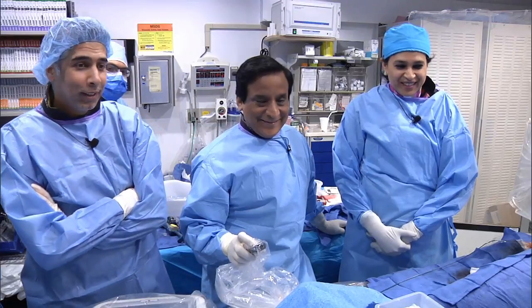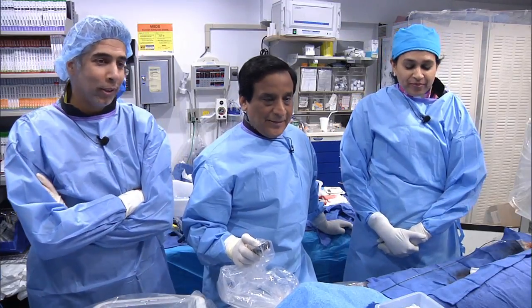Yeah. There are two quick questions I have to take. One, Dr. Syed from Oman. He's emphasizing that the fellows and all of us should be trained in both radial and femoral, and I think he's absolutely right. Nitin, question directed at you. In the elderly, which catheter do you use to hook the left system? And specifically, this is Dr. Ajay from India, mentioning that it's much harder to do it with the EBUs.